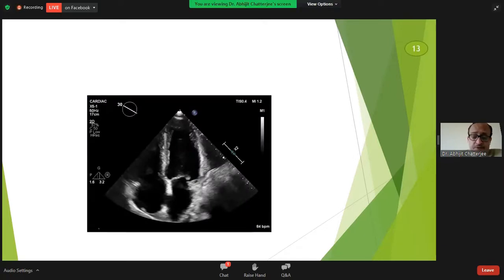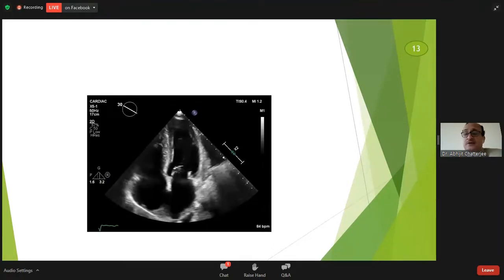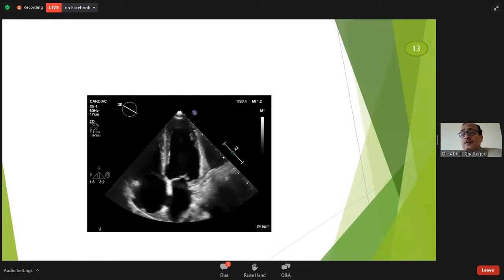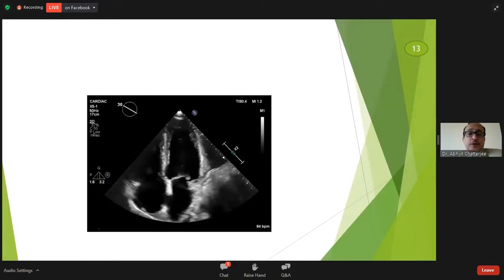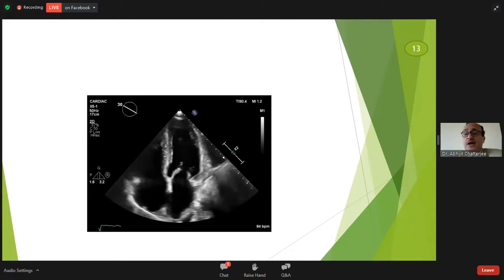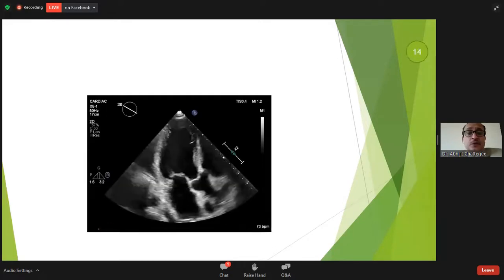This is another patient who I saw earlier this month. He has got a history of repeated myocardial infarctions. No intervention could be done because his renal function was poor, and you can see a dyskinetic apex, dyskinetic apex, and very poor systolic function. More about this diabetic and hypertensive patient as we go on along this discussion.